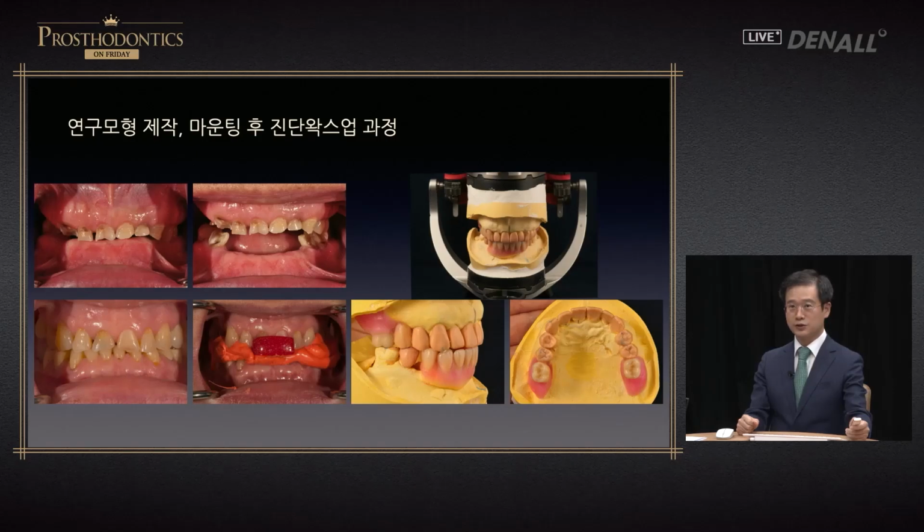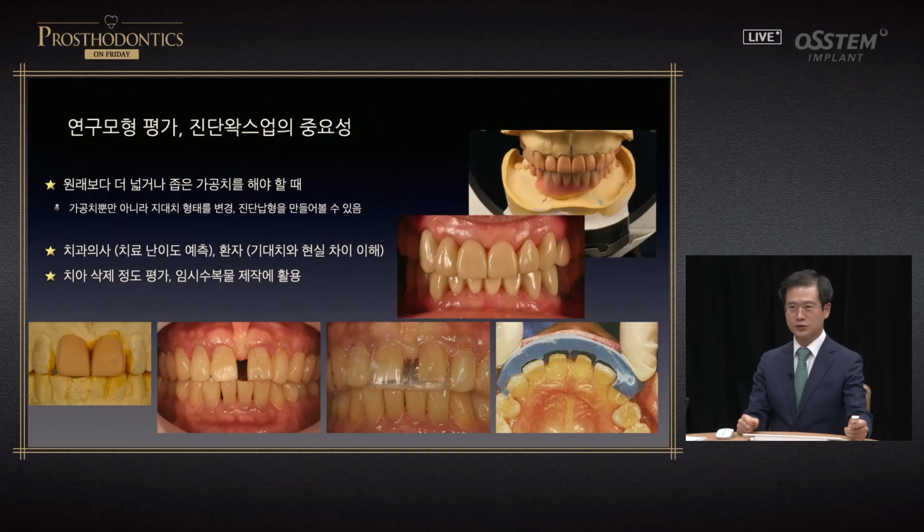The reason why we use the articulator is because, as shown on the left, if the occlusion is completely collapsed, we mount a CR and replicate jaw movement. This is reflected on the virtual articulator. Wax up is done, and we come up with a blueprint for treatment.